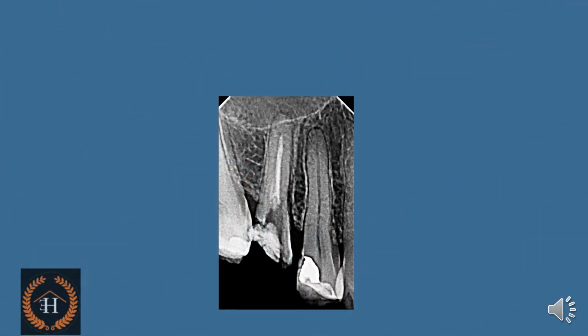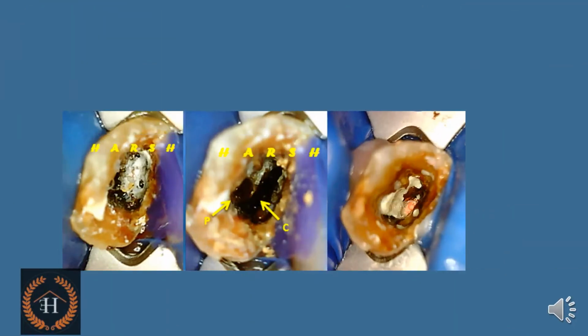Now here's another case of an upper premolar which was referred for retreatment. Despite it having a supracrestal and supragingival margin, this is to illustrate how we can adapt the same methodology in restoring this tooth. After the retreatment was performed, a wall was formed on the distal aspect of the tooth from the gingival margin till the occlusal surface with liquid dam, and it was light cured.